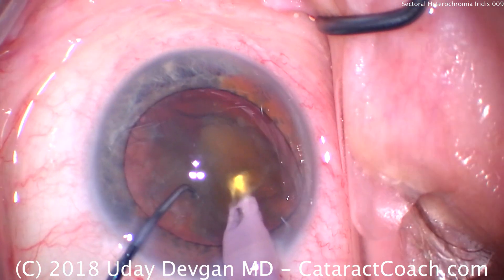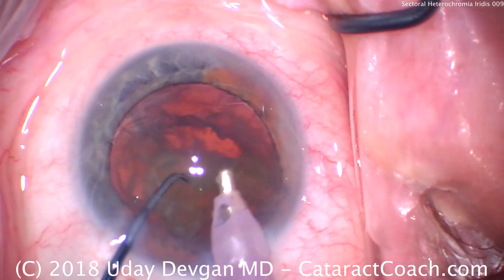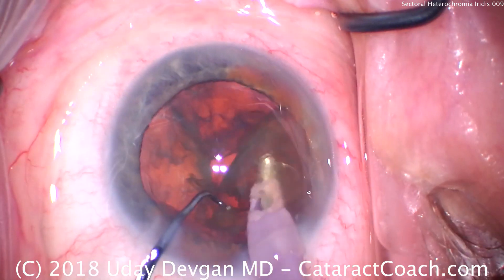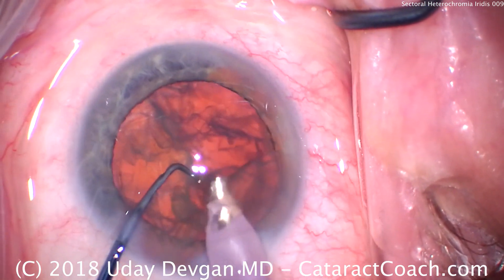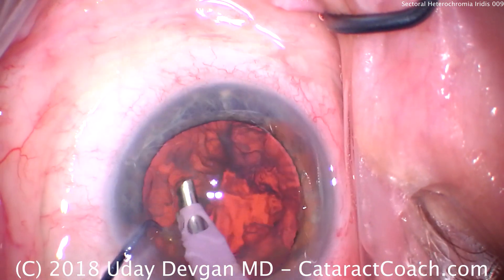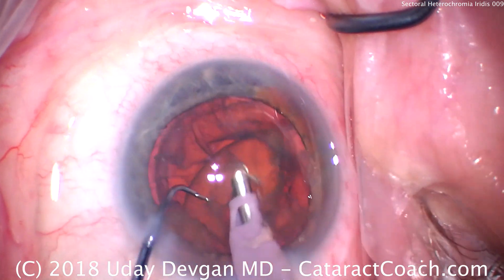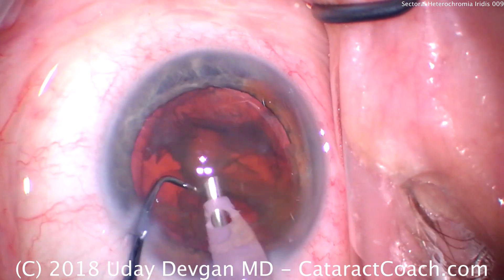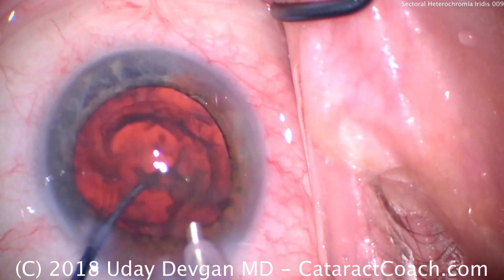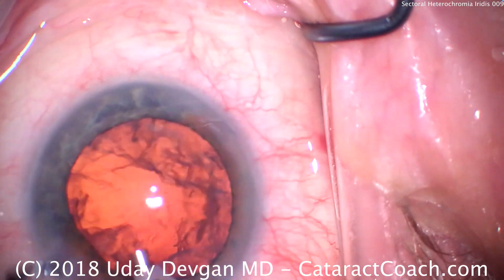In the first half, we can buzz in again and sub-chop. Now we have a quarter. Take out that first quarter and then the piece below it — we should have about half of the nucleus remaining. We're using higher flow settings here, high vacuum, low phaco energy. This is not a very dense lens. Here comes the second half; we're trying to buzz into it just to bring it up with vacuum. We didn't get a chop — that's okay, it's relatively soft. We'll just push the piece in front of the phaco probe using the chopper, which is now in the safe position to prevent any surge from causing the posterior capsule to come forwards.